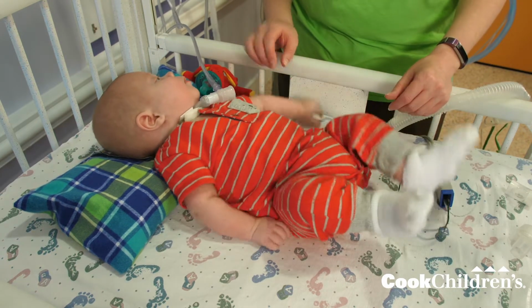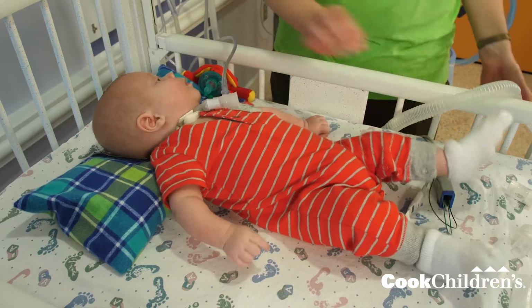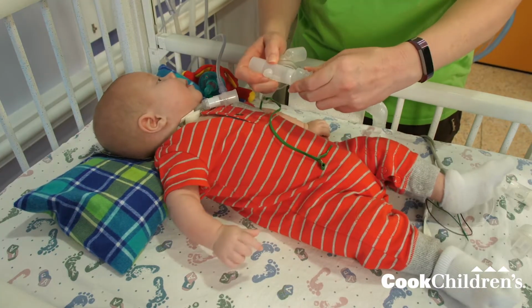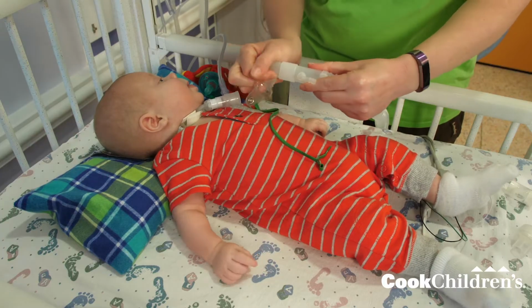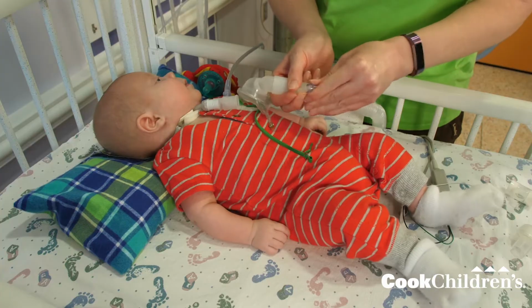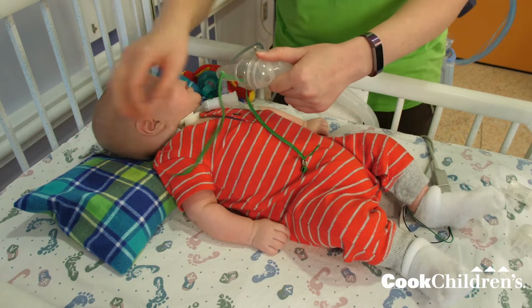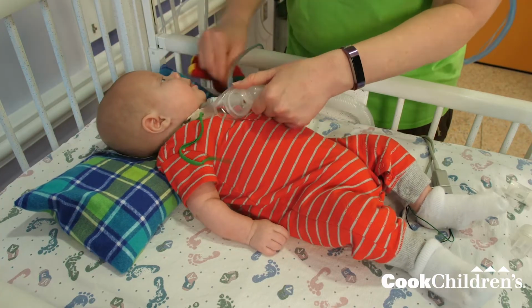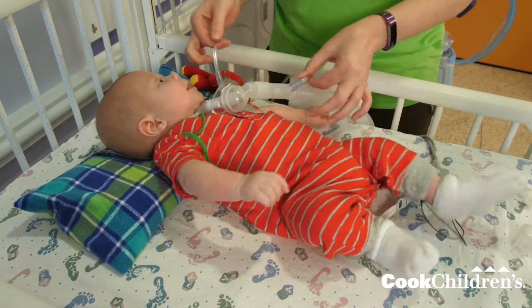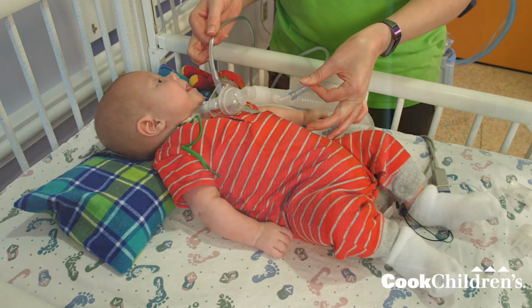If a child with a trach needs more than 2 liters of oxygen, use the pressure line adapter. The pressure line adapter connects between the trach, mask, and the humidification tubing. Attach the oxygen tubing to the port on the side of the pressure line adapter and to the oxygen source. The pressure line adapter can be used to give high levels of oxygen.